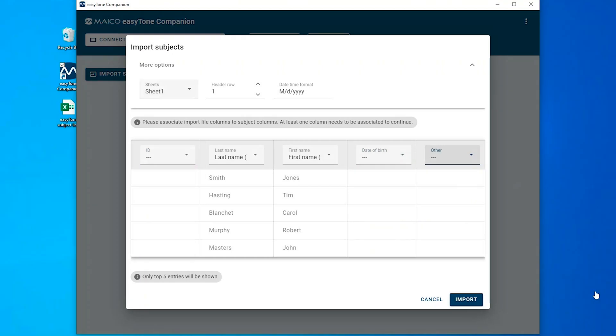This screen allows for correct association of the column titles between the imported list and the easyTone Companion software. Use the dropdown next to each column title to match the title from the Excel or CSV document.